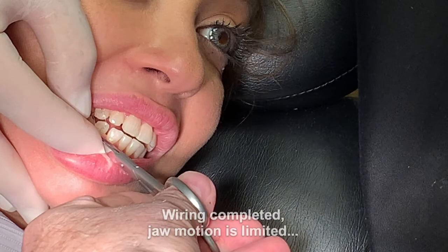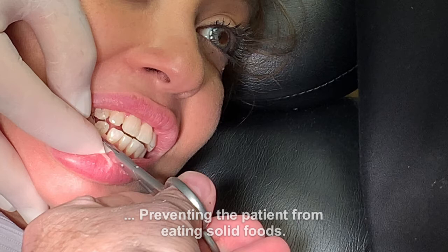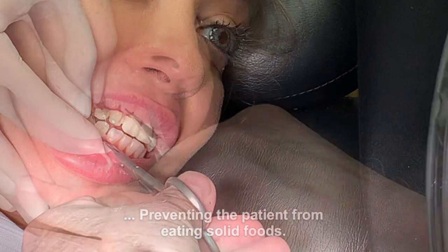Like its predecessor, OJW Weight Control, the purpose of OJW Ultralite is to limit the extent of Gloria's mouth opening, thereby preventing her from eating the solid foods that cause her to become overweight.